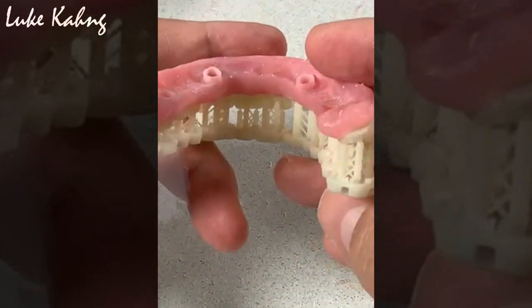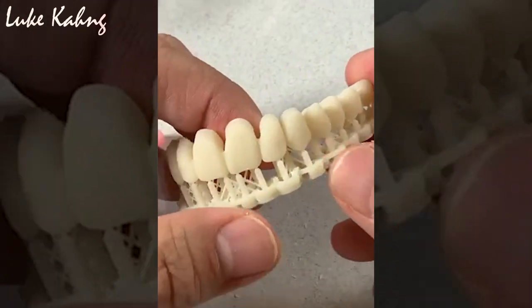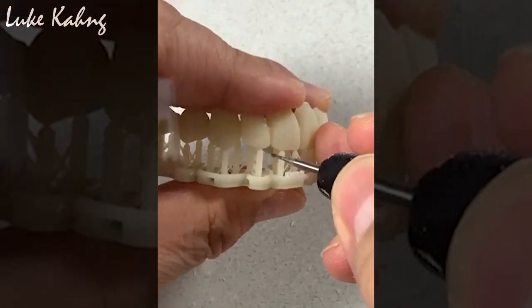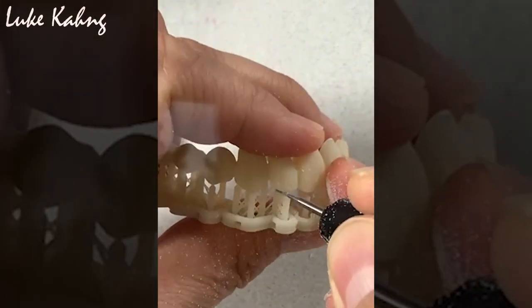Four implants. And then now — try to remove it. I think this is the problem.